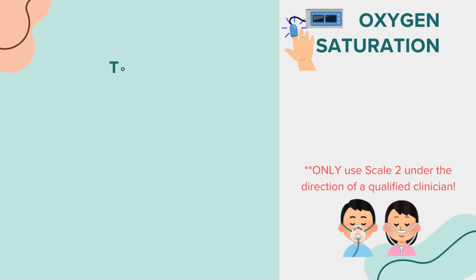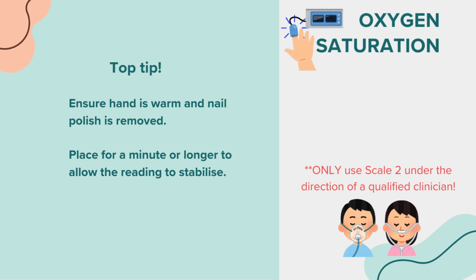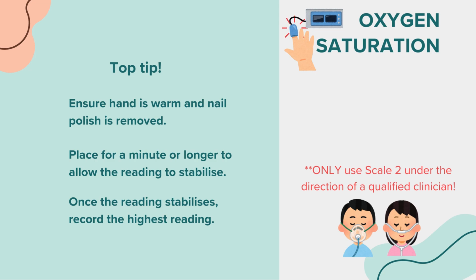notes. Top tip: ensure the hand is warm and nail polish is removed. Place for a minute or longer to allow the reading to stabilize. Once the reading stabilizes, record the highest reading.